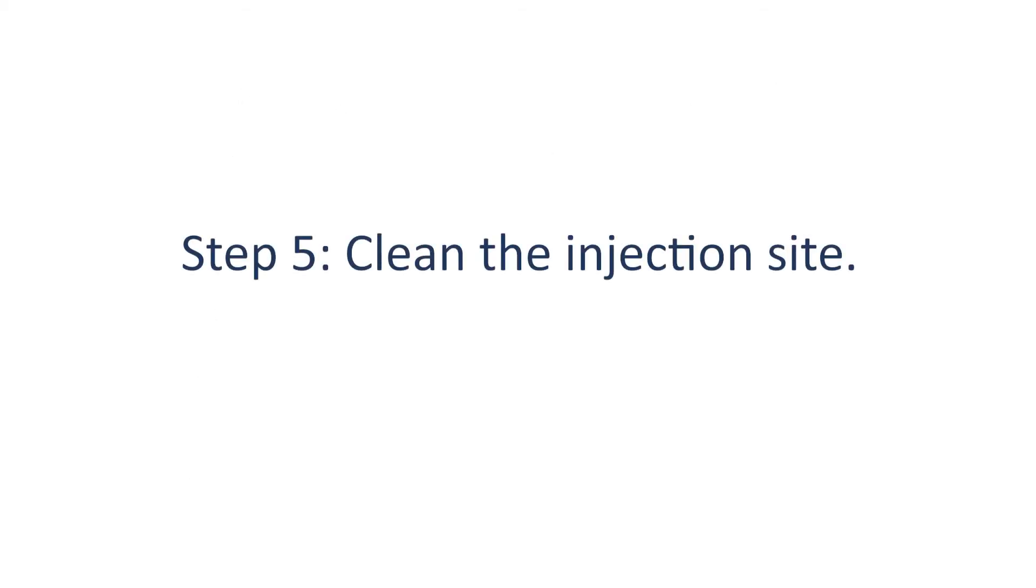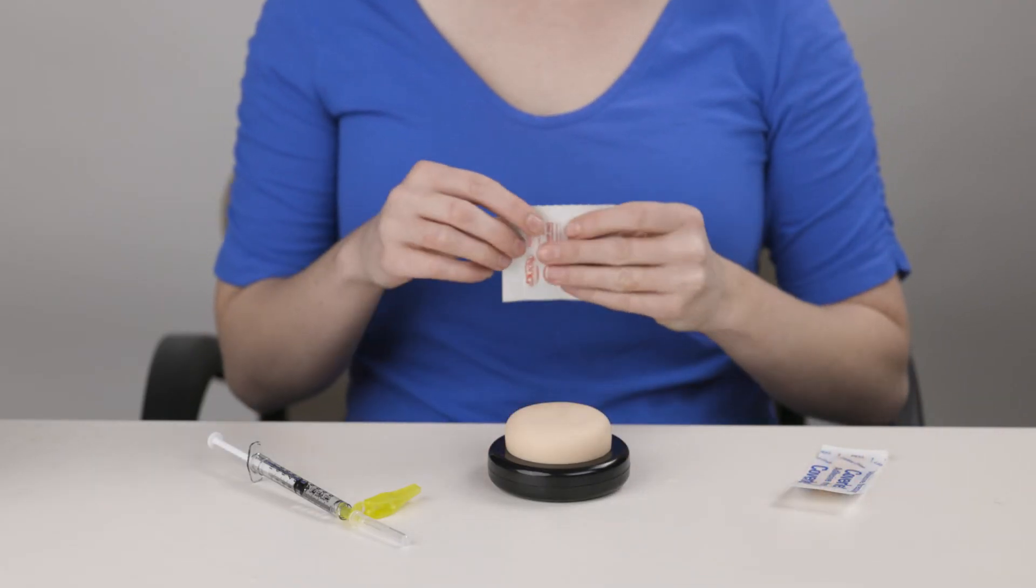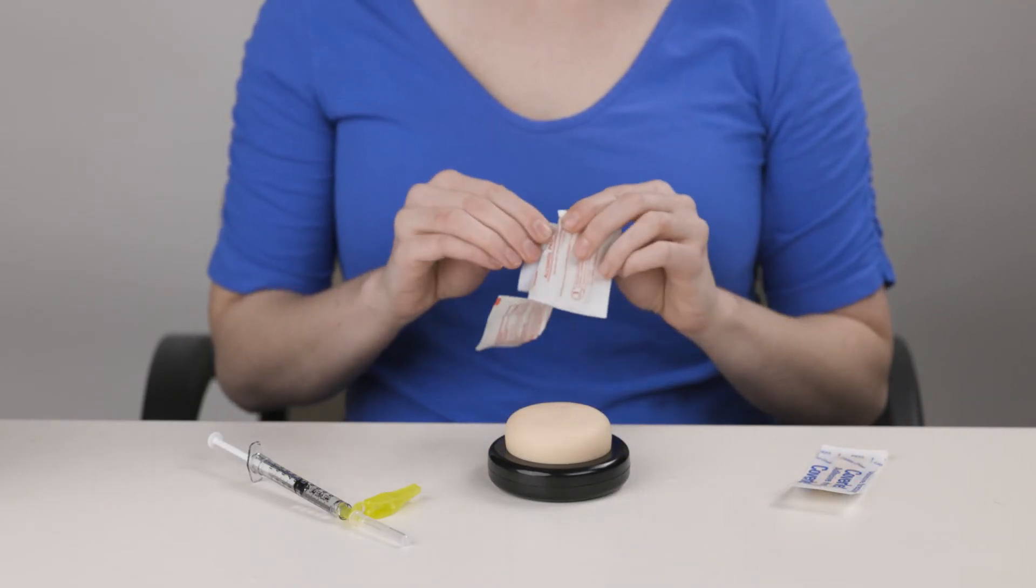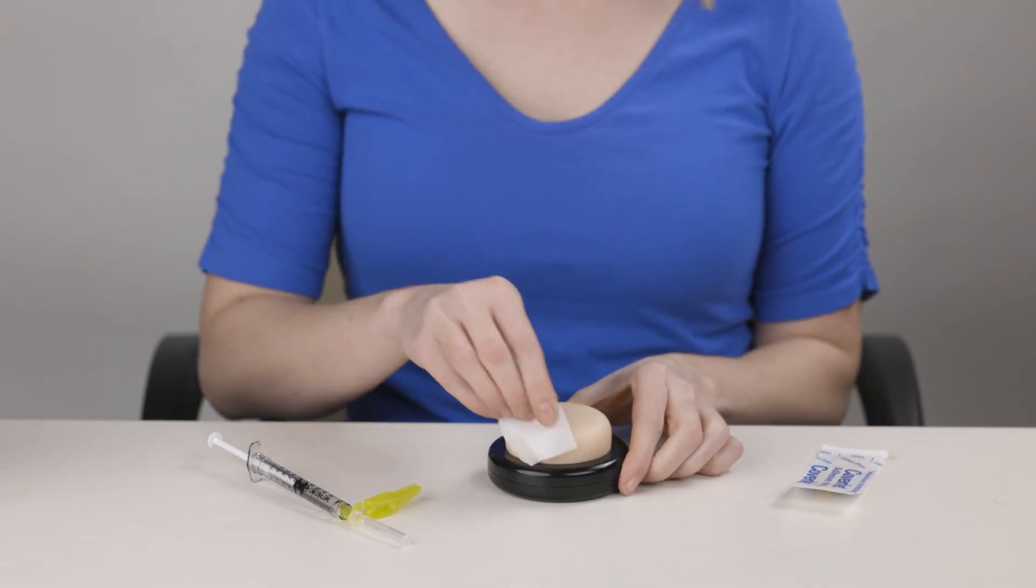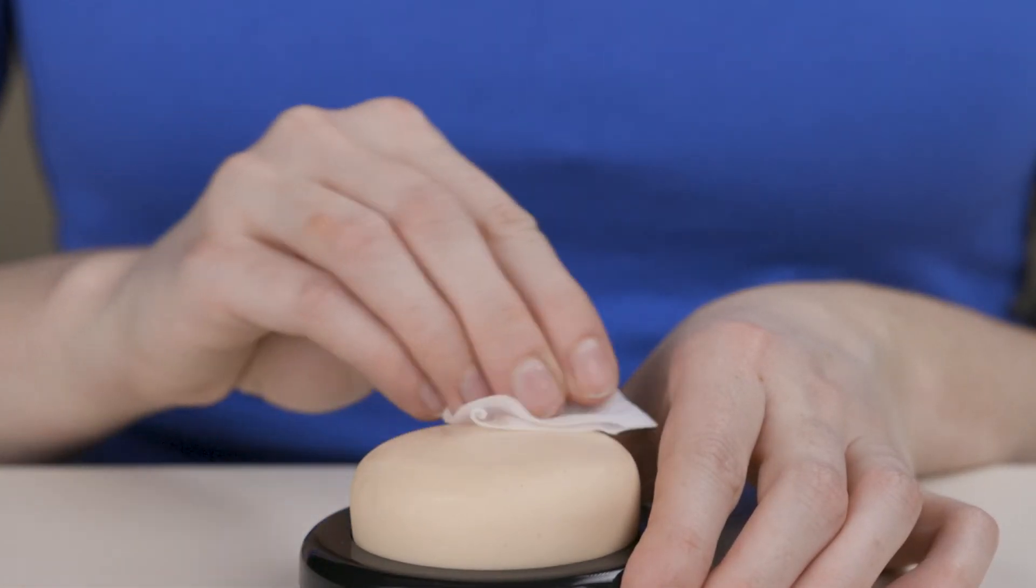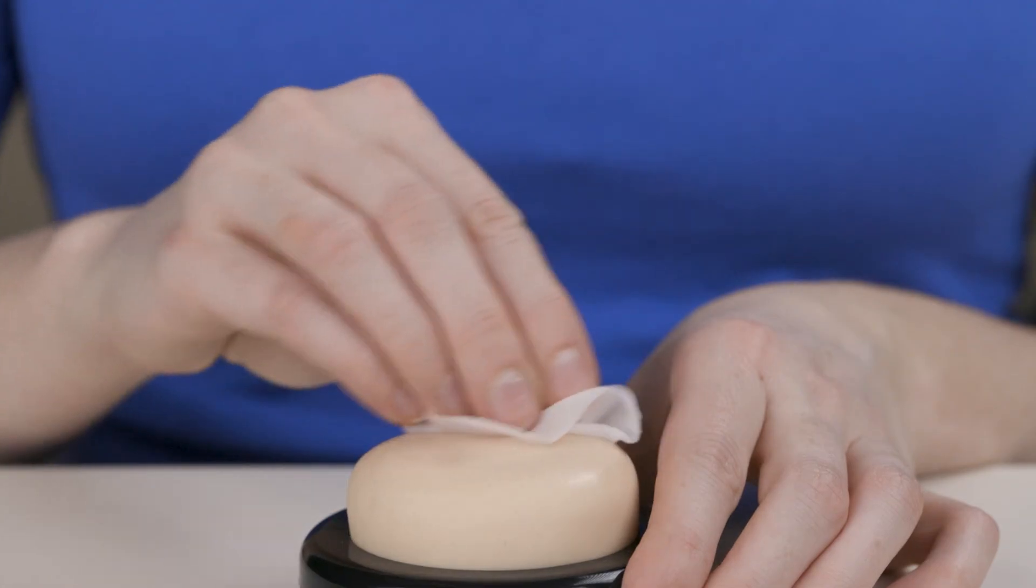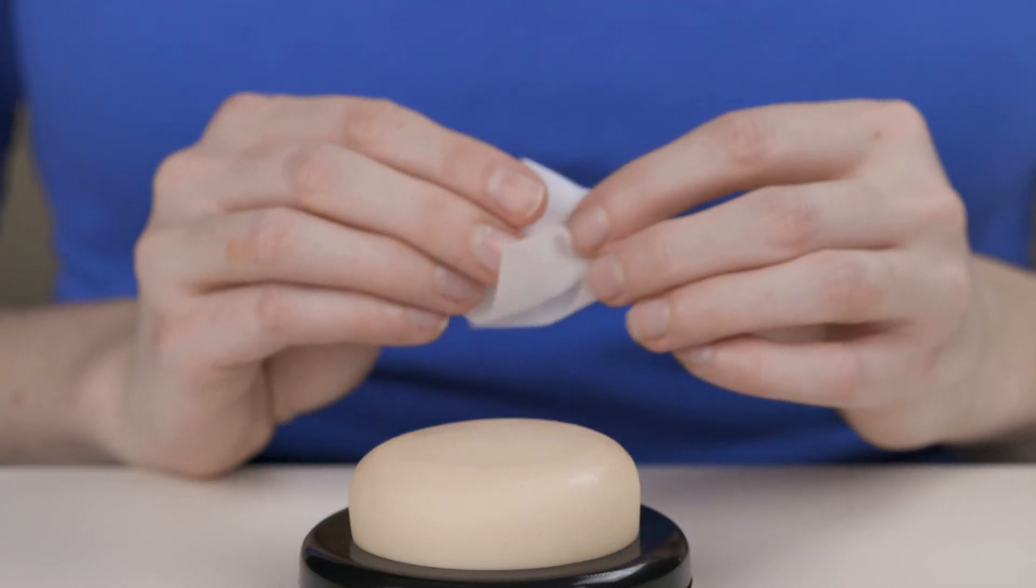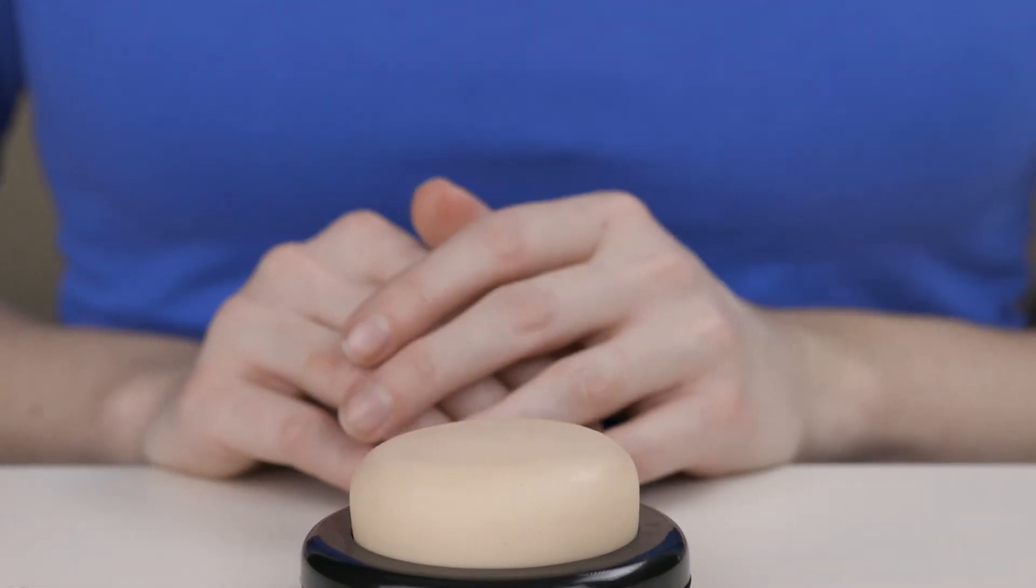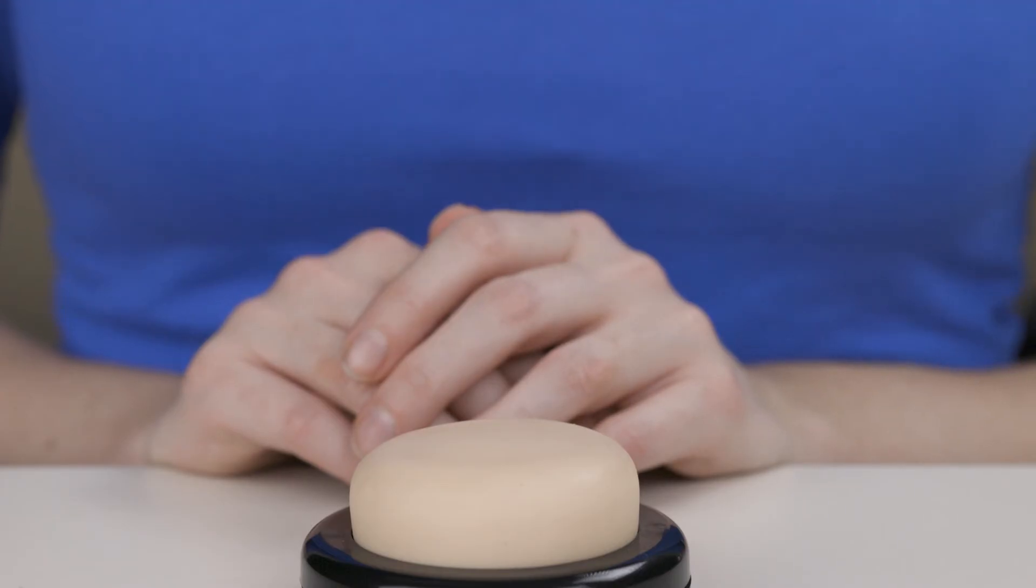Step five, clean the injection site. Open the alcohol wipe and clean the injection site with the wipe. Wait a few seconds to allow your skin to air dry. Don't touch or blow on your skin.